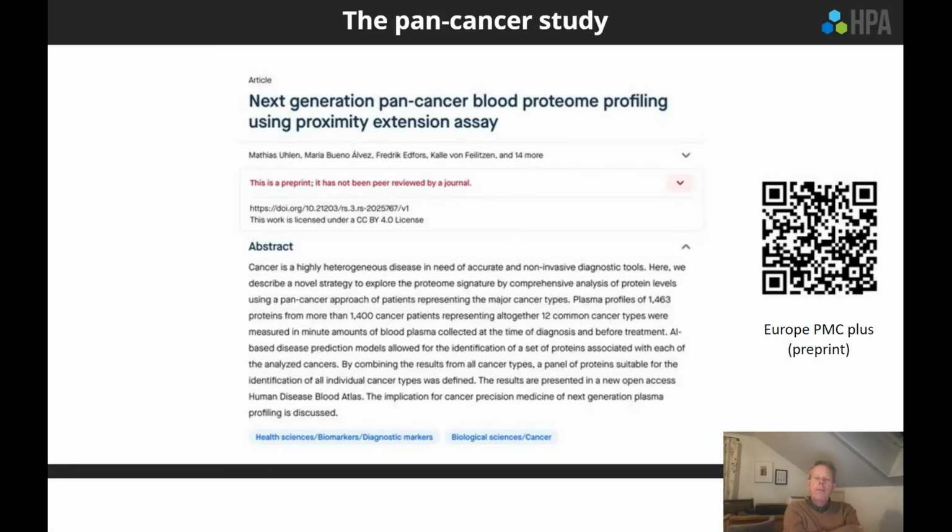They are certainly surprising in some cases, and certainly very expected in some cases. So the main biomarker for glioma, for example, is a very well-known brain protein. There are also, for the ovarian cancer, well-known female proteins. Other proteins are expressed or produced in the liver, so this must be secondary effects. And some of the proteins are intracellular, so they are obviously leakage products, probably.